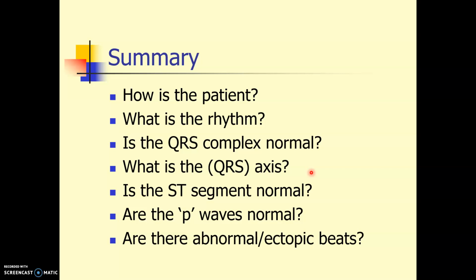In summary, we have continued to use our structured approach to diagnose our ECGs. The next lecture will look at ST segment changes due to electrolytes and drugs.